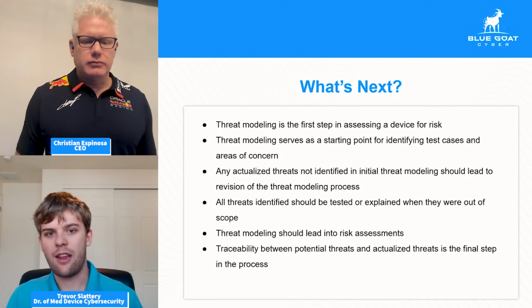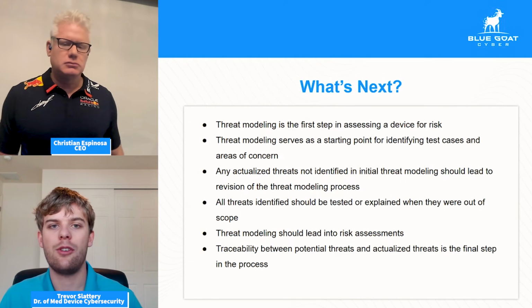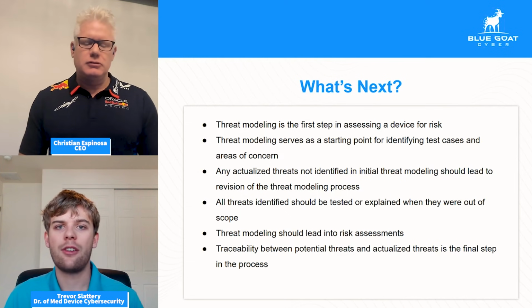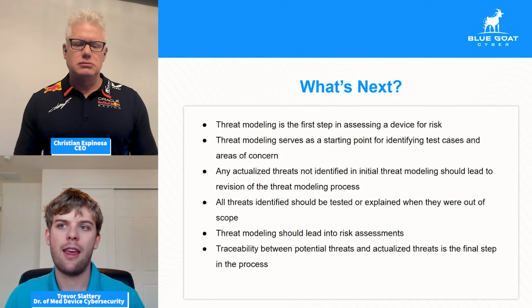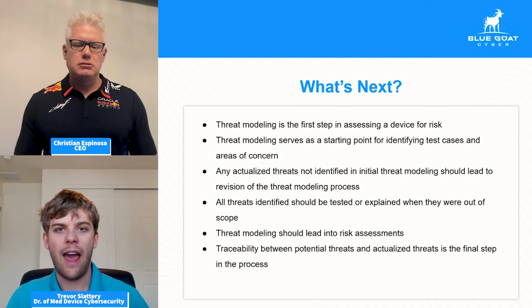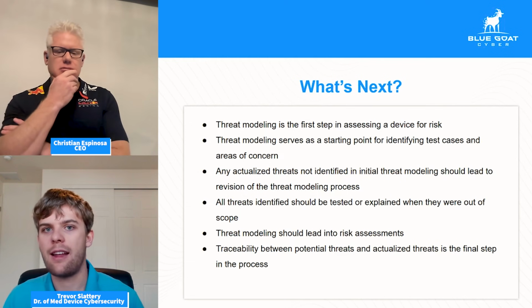Threat modeling serves as a starting point for identifying any of the areas of concern, what test cases need to be developed to stem into that penetration test, stem into that risk assessment, understand everything that can come after the fact. Once all of these threats are identified as part of threat modeling, they can be translated into test cases. We can go back to the example of accessing that database and accessing user credentials in that database. We take a look at what is in there. How are we going to test whether or not that's possible?